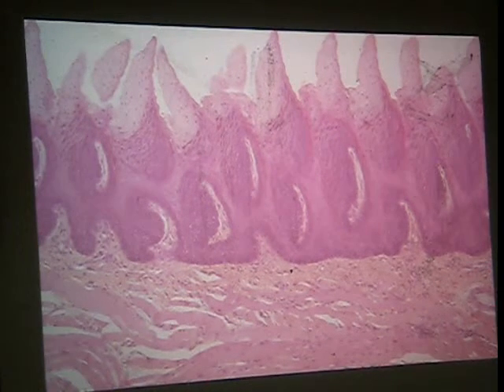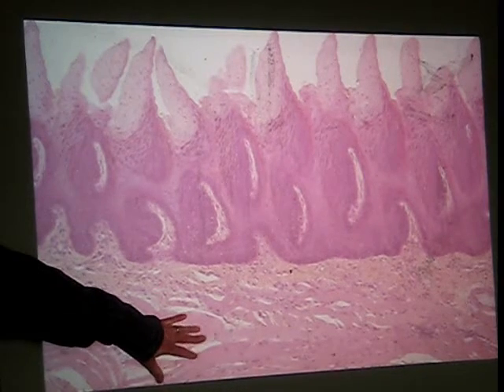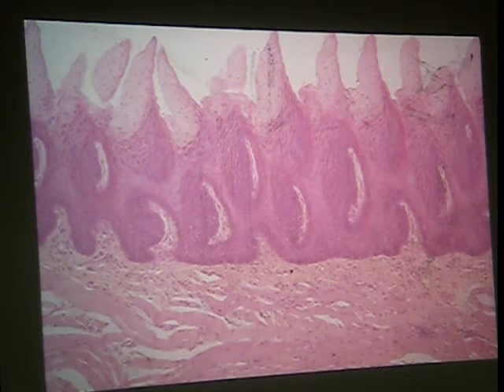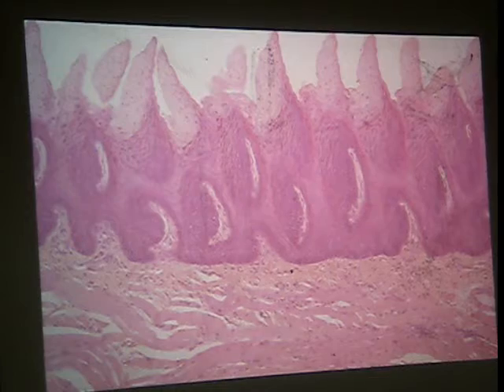And what kind of papillae? Filiform papillae, right? You can see down here we've got the visceral striated muscle, remember, that runs in X, Y, and Z planes, which gives us the exquisite mobility that allows us to speak.